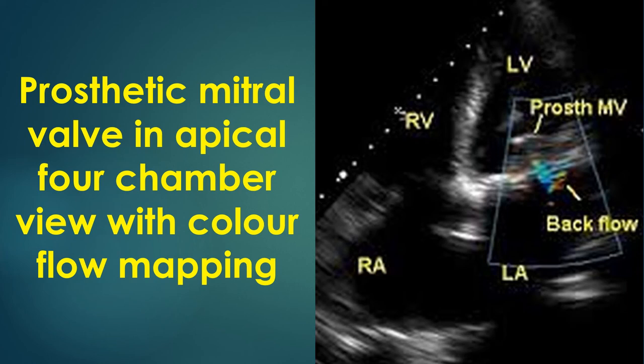This view is also useful to look for paravalvular and transvalvular leaks. Early onset of paravalvular leak may indicate the giveaway of a surgical suture.